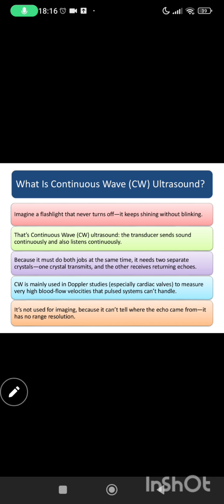And what happens in pulse wave Doppler? In pulse wave Doppler, we transmit, we wait, and then we receive. There's only one crystal, which transmits and receives. The sample volume is placed in the middle of the vessel. So, pulse wave tells us more about the blood flow.